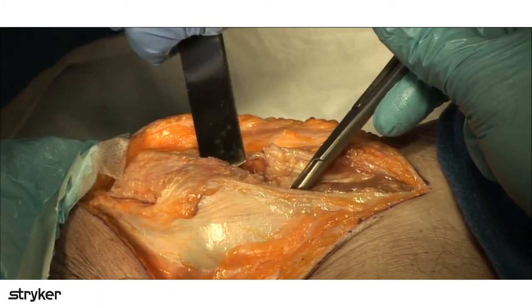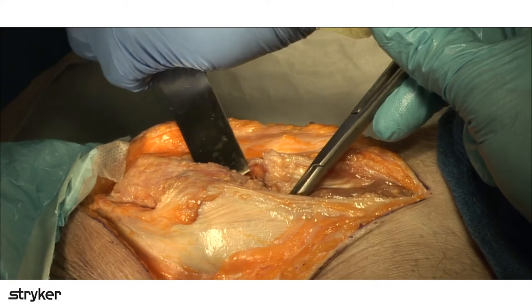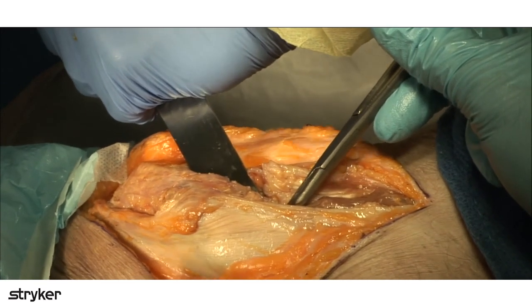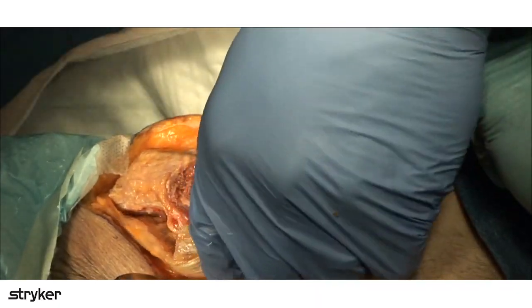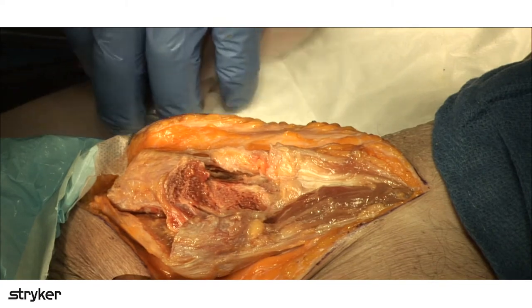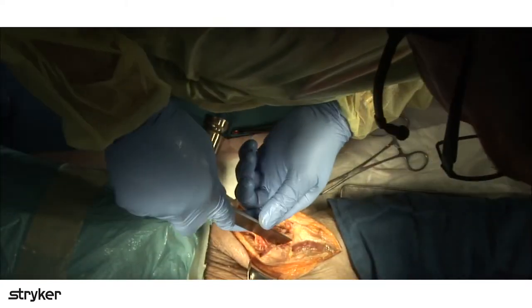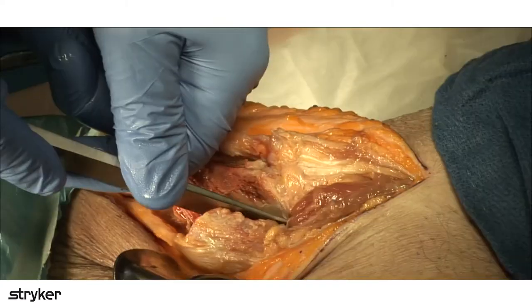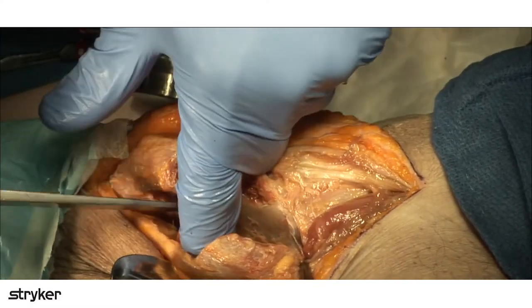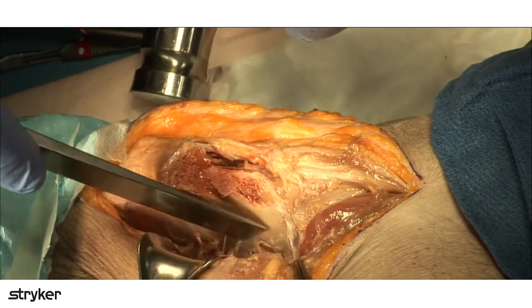Marcus, do you pre-drill your osteotomy before you do it? I don't usually. Do you? Nope. How do you fix it? With a single screw, usually, just a single 3.5 screw is all it takes. Sometimes your fracture will involve some of that, and you may have to get a little inventive with your osteotomy when that's the case.